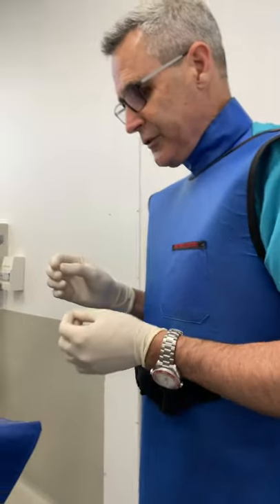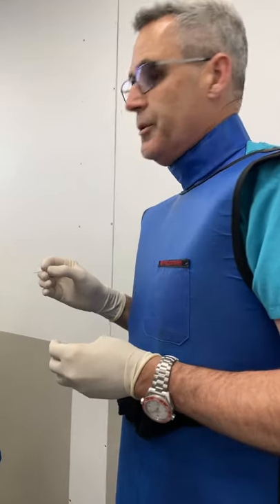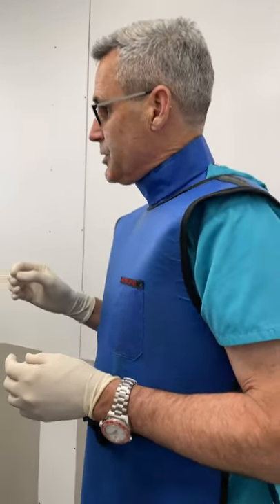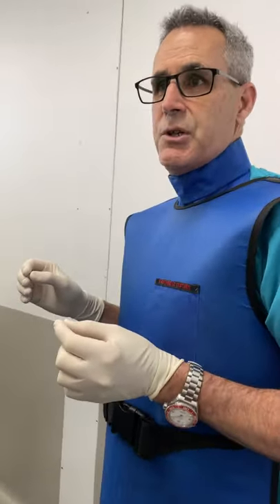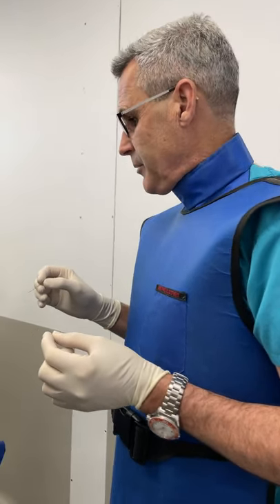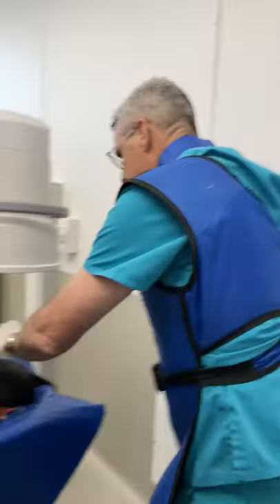Hi guys, this is Charles. I'm one of the surgeons at Southpaws. I've got this little classic dachshund presented with a history of hindlimb paresis and so we're doing a myelogram. We've already done a CT scan which was suggestive of a disc rupture at T12-13 on the right-hand side, and we're now doing a myelogram to confirm that that's where our compression is.